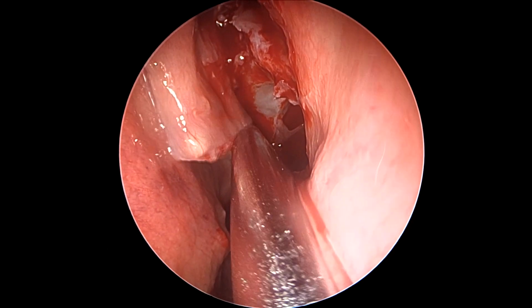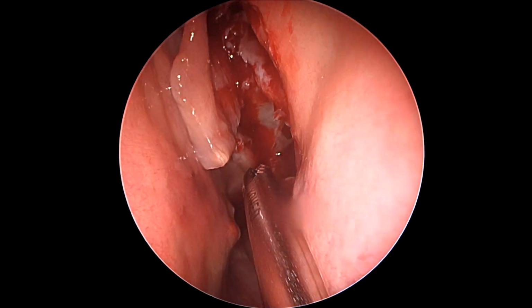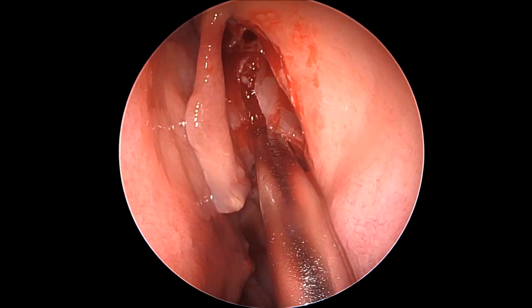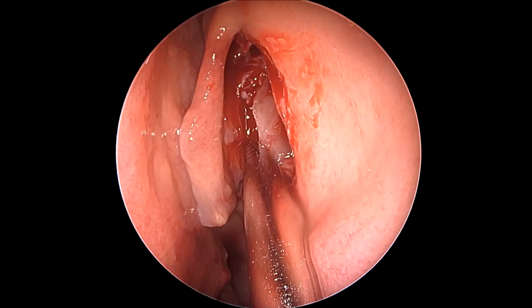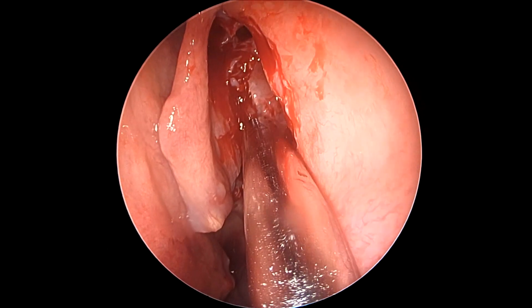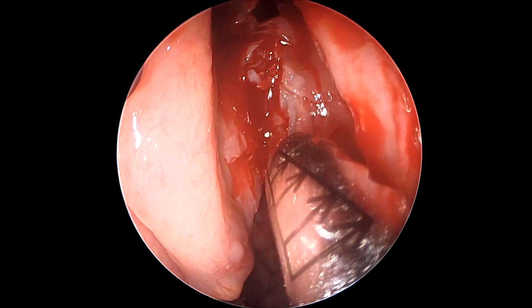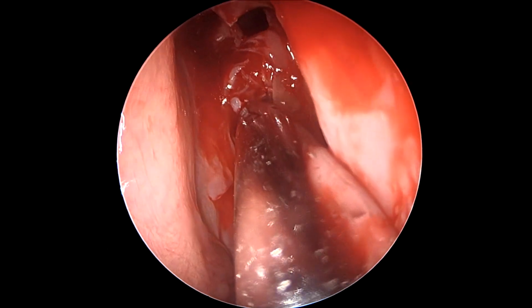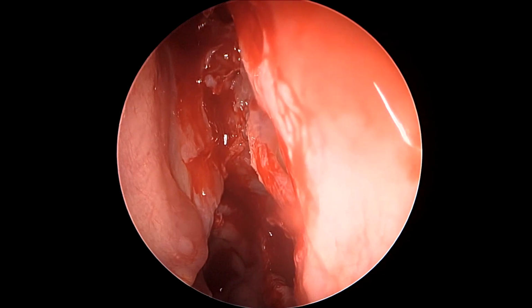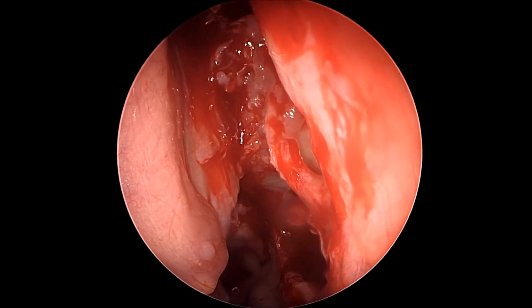So as we reduce the posterior half of this polypoidal, atrophic, thinned middle turbinate, we are removing now the excess part of the bulla ethmoidalis, trying to make it flush to the lamina papyracea. And behind the bulla ethmoidalis, one can already see the frontal recess superiorly and the basal lamella.